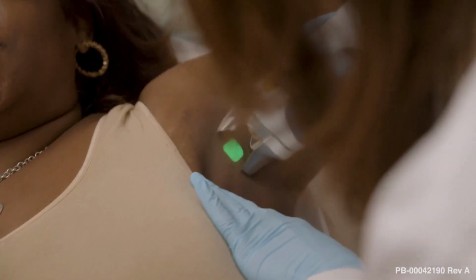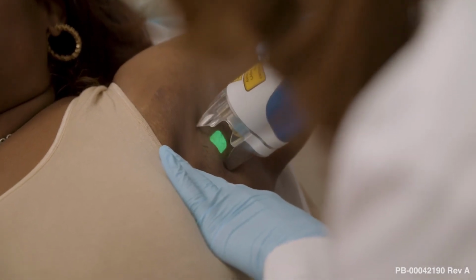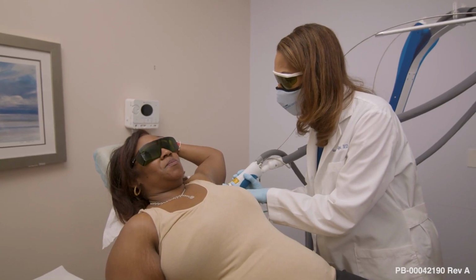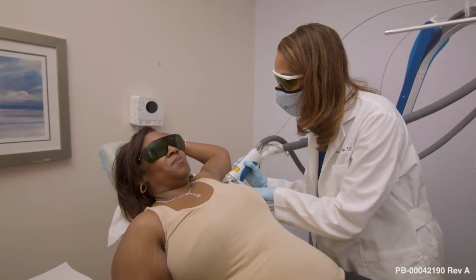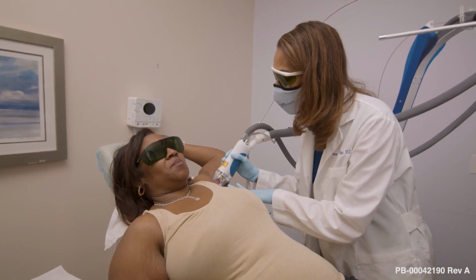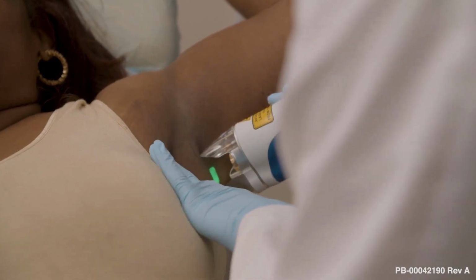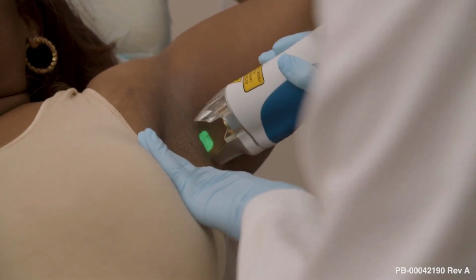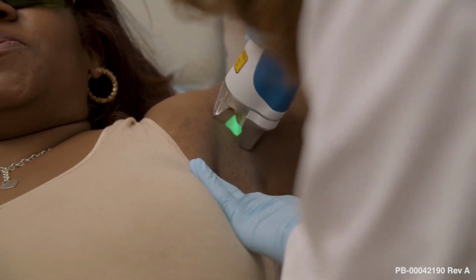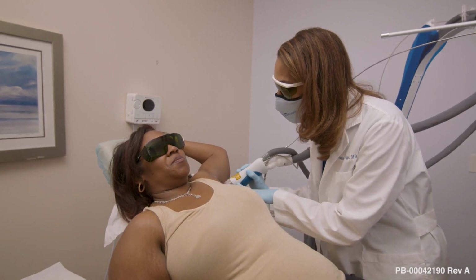So each time I treat, I can see a little bit of crinkling of the hair, and I smell hair. I just heard a little pop. I listen for that. Prior to treatment, a test patch was done, so I already know that this energy works well for Annette. I'm looking to make sure I don't see any really rapid, quick redness. I don't see any redness actually, none at all. I'm listening to make sure I don't hear a very, very loud pop.